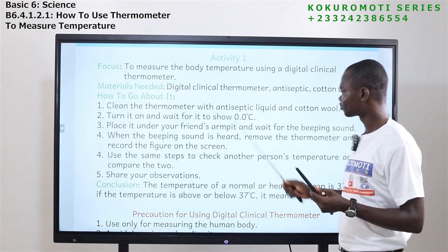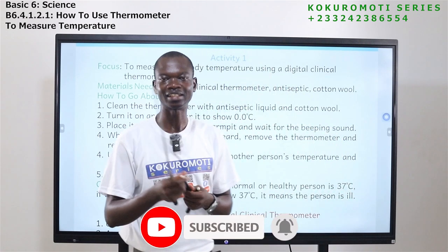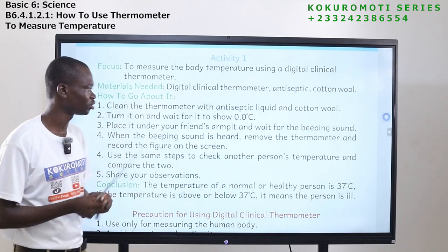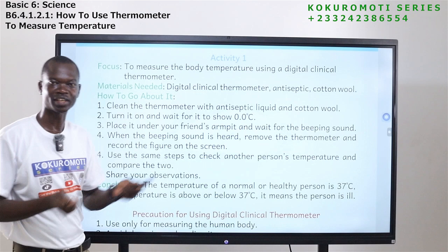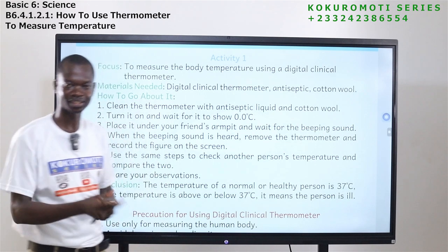You use antiseptic liquid. That one will kill germs, will kill bacteria and other infections. It kills germs, all microorganisms that can affect the next person. The antiseptic liquid will kill it, and after that you use cotton wool to clean it.